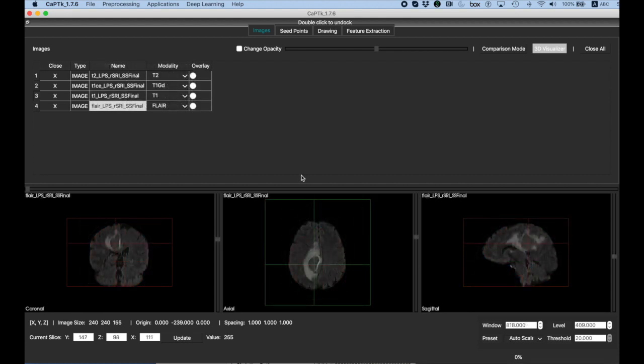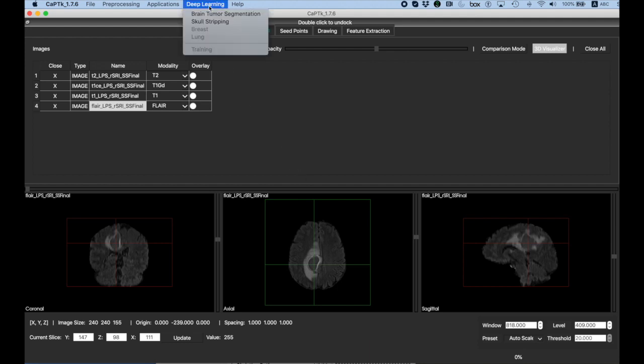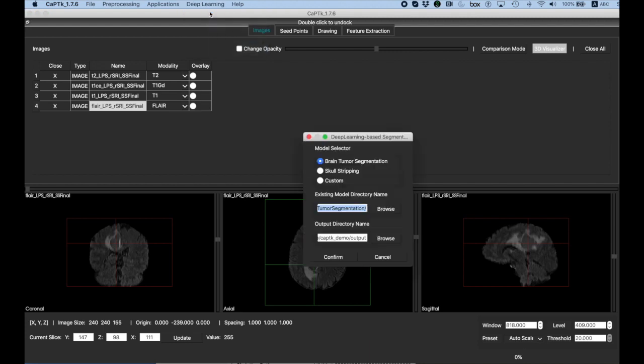Moving on, now that we've segmented the brain, we have skull-stripped images that we are going to segment the brain tumor from. To do this, we're going to the Deep Learning menu and select Brain Tumor Segmentation.